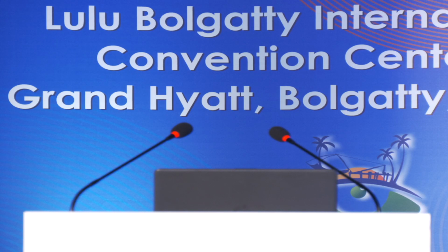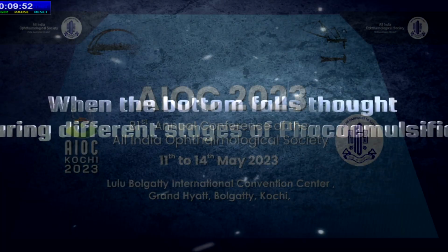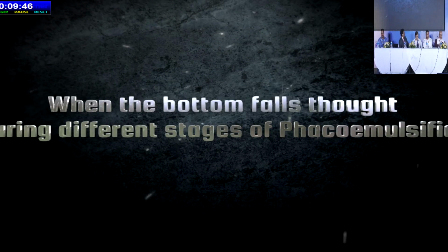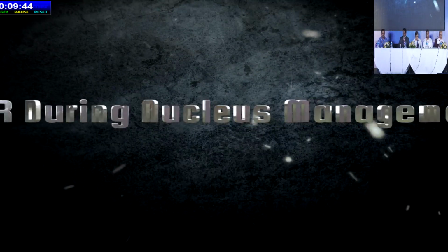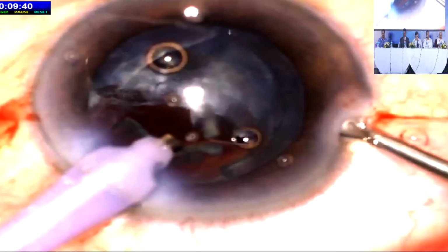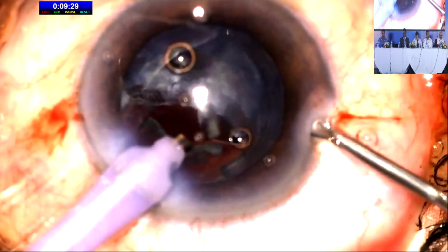Let's discuss a few clinical case scenarios wherein a posterior capsular rupture occurs during different stages of phacoemulsification. Let's start with the first case. This patient presented with a PCR intraoperatively towards the end of nucleus management. One small fragment has dropped down into the posterior segment as well. Let's see how we manage this case.